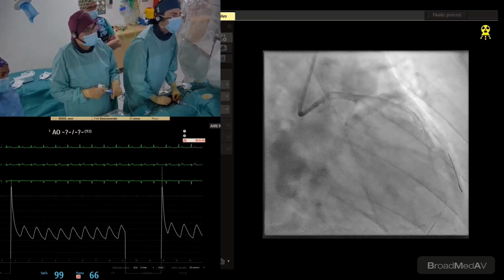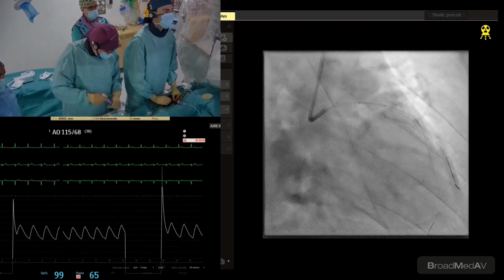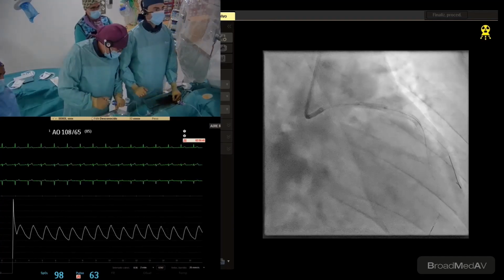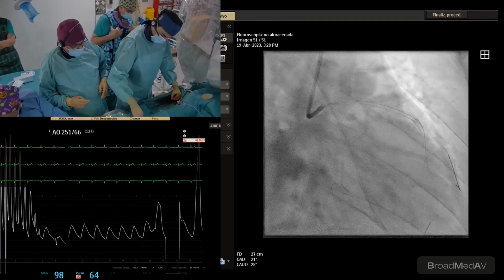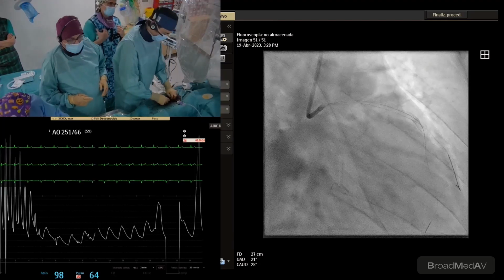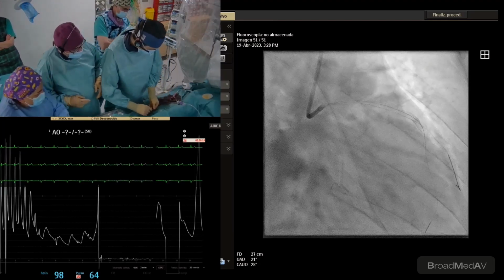Test, please, because the patient is moving. Okay, implanted. 12. Okay. So I think we can check with OCT, no? Put some nitroglycerin, do the angio, or use the OCT angio just to save contrast.